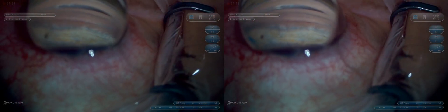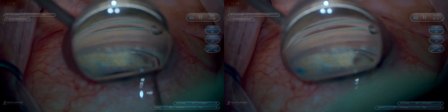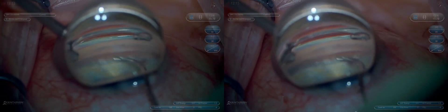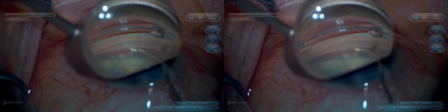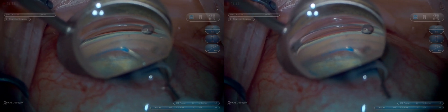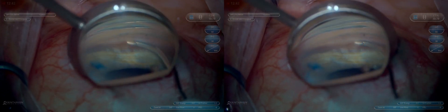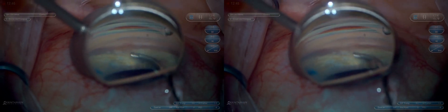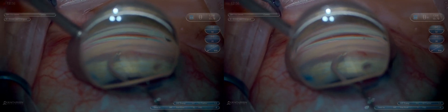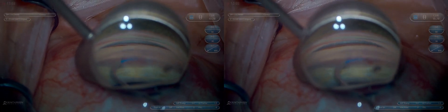This is the Omni device for goniotomy canaloplasty. It's important to point up slightly but not too much, because we want this to get into Schlemm's Canal and not dive posteriorly into the suprachoroidal space. We like to visualize it passing through Schlemm's Canal just below the TM. Now we'll rotate the Omni to the other direction in preparation for 180-degree goniotomy. There's no viscoelastic left in the cannula; we'll fully extend it and then pull it back through the trabecular meshwork to perform approximately 180-degree goniotomy.